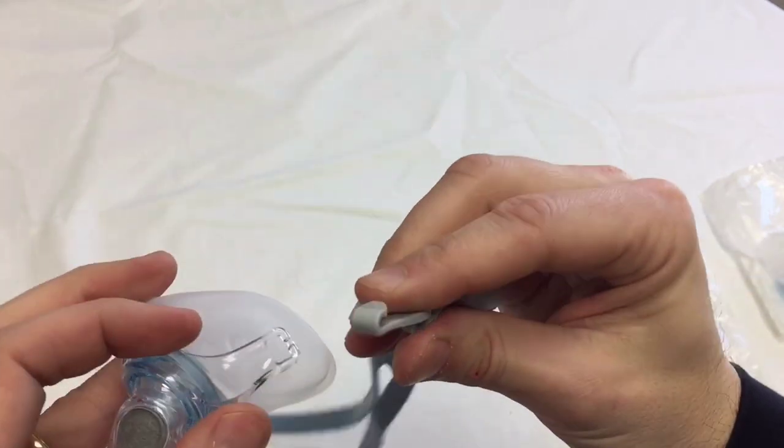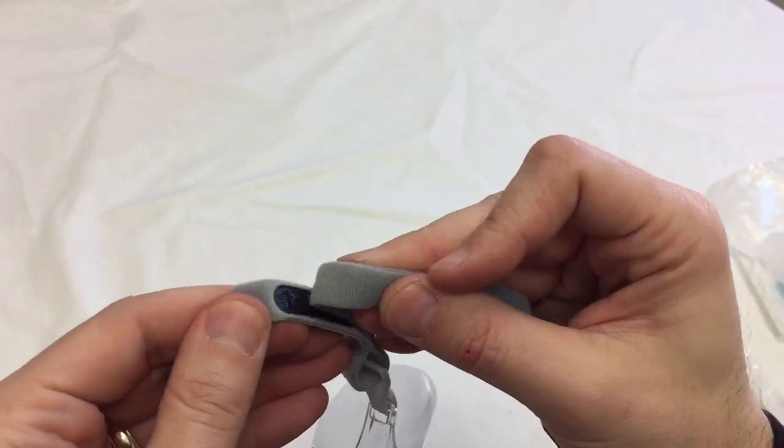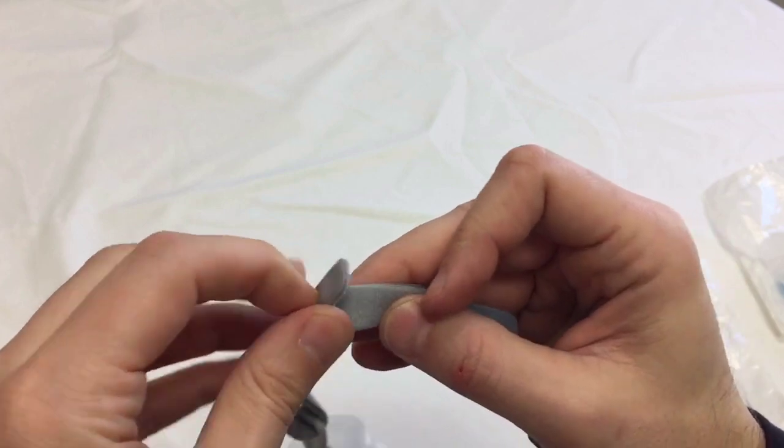Here we have the headgear clips, easy to get on and off. So once you have the Velcro set on the headgear where you'd like it, you can just take the mask on and off with the headgear clips.